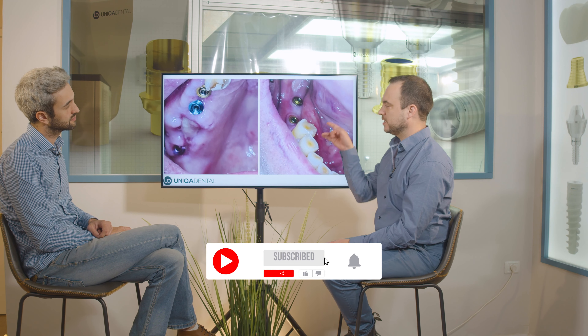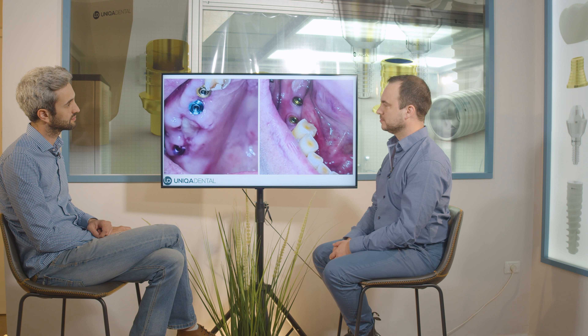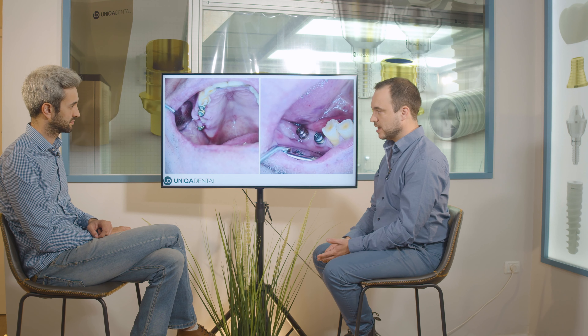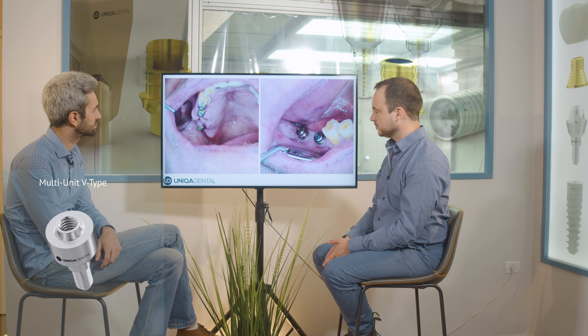On the lower jaw we have two regular multi-units. On all the implants we needed to make new crowns, so we first removed the bridge, placed multi-units, and let the area heal a little bit with healing caps on both upper and lower jaw.